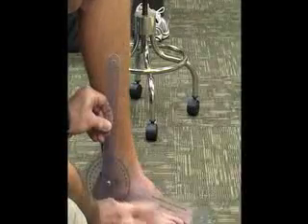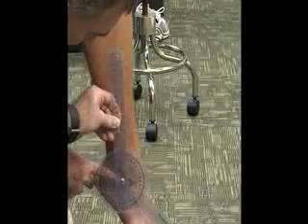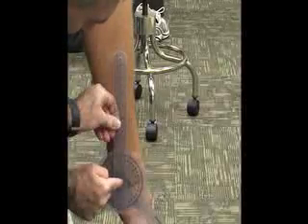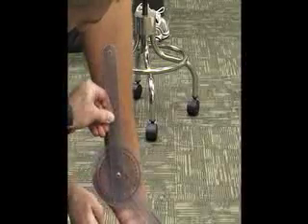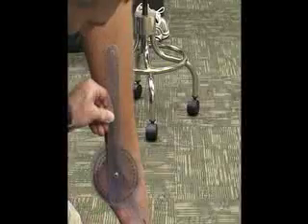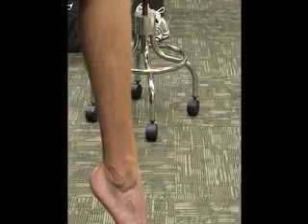For this one I'm going to ask him to plantar flex — point his toes down. Trying to maintain my landmarks parallel and in line with the lateral malleolus, keeping in line with the fibula and the fifth metatarsal bone. Normal for this is going to be 50 degrees.